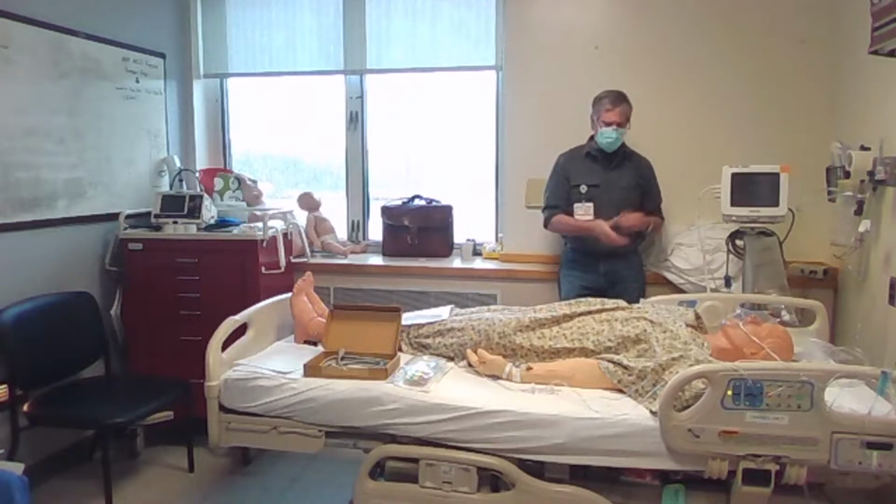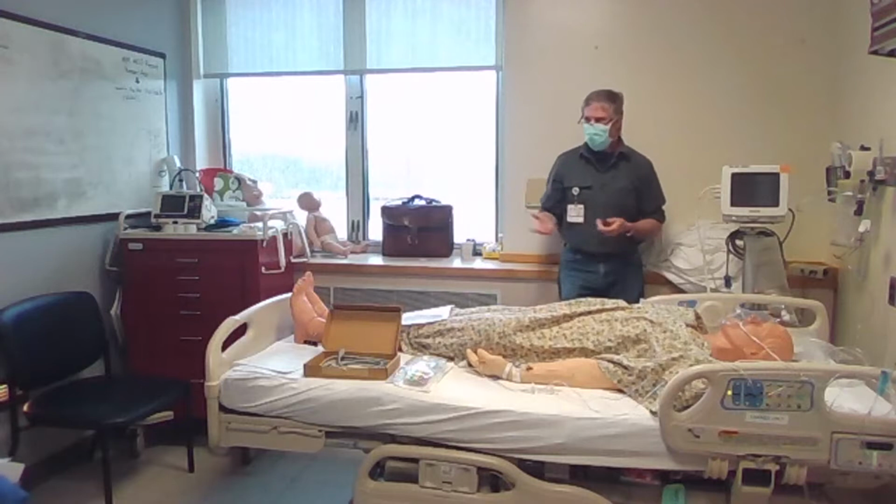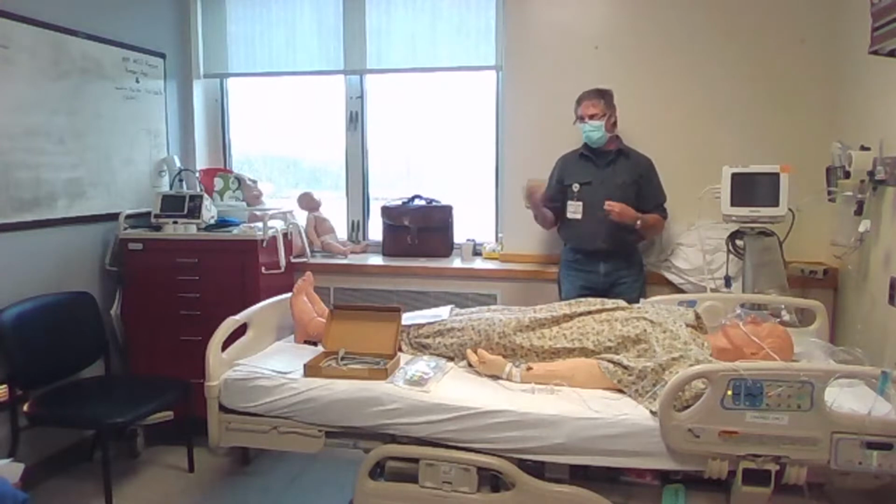But the other ones that it really doesn't cover, because this is straight from an anesthesia text, is you do it in codes sometimes, especially when we're going to be doing vasoactive medications. You do it in the ICU a lot, when you're going to be running vasoactive medications. The whole reason behind the A-line is because it gives you continuous blood pressure readings, instead of a non-invasive blood pressure cuff that's going to go up every 3 to 5 minutes maybe, or you set it for 15 minutes or whatever it is. So that's why you put them in.